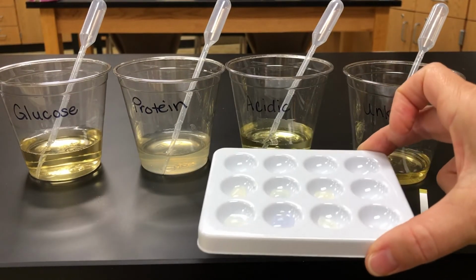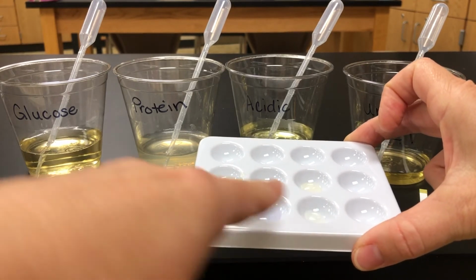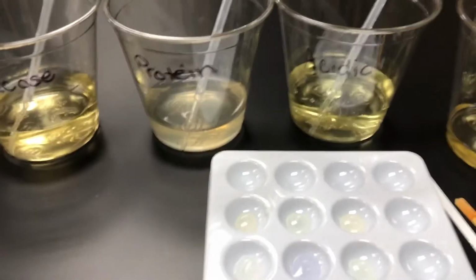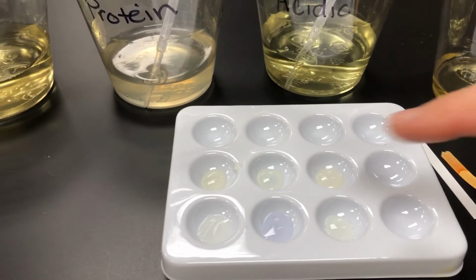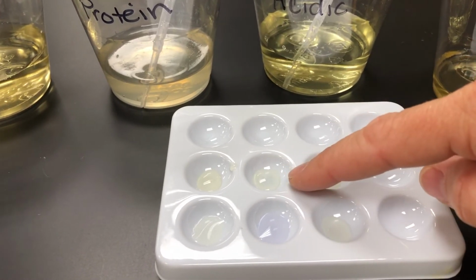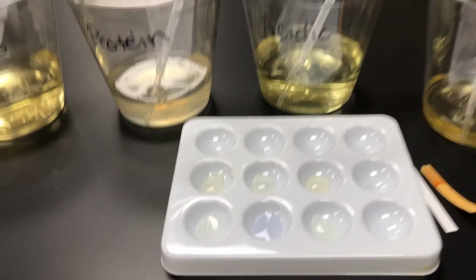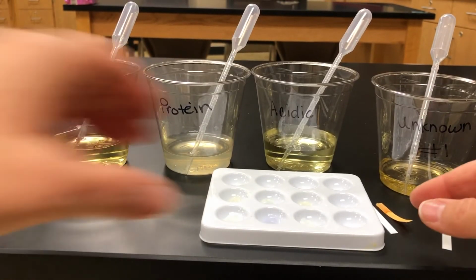Okay, so you guys can see that. Again, this is our part A. Okay, this is our part B. So this is the one that you want to look in. Let me see if I can get that a little bit more on top of it. Okay, so we're looking right here at this one. Again, this is our part A. This is our part B. Okay, did it turn purplish gray? Yes or no? What does that mean? And record your observations.